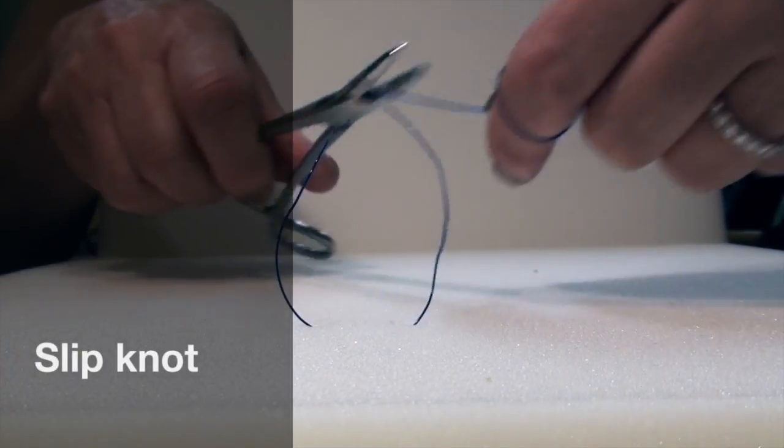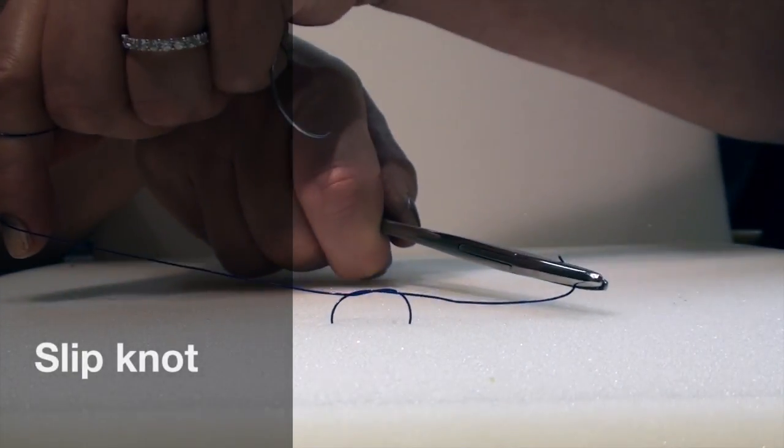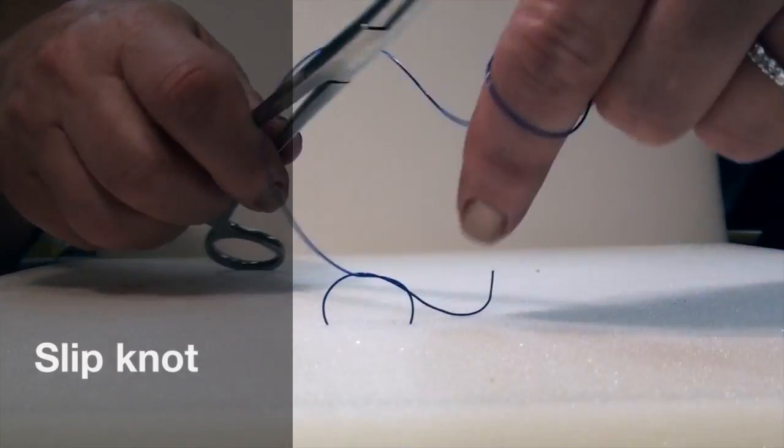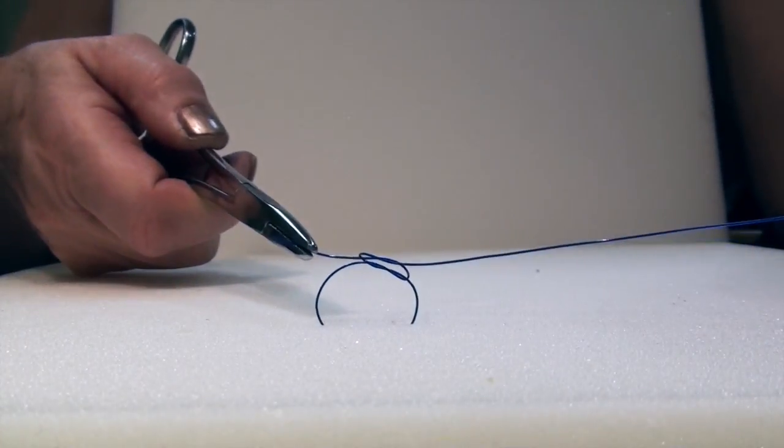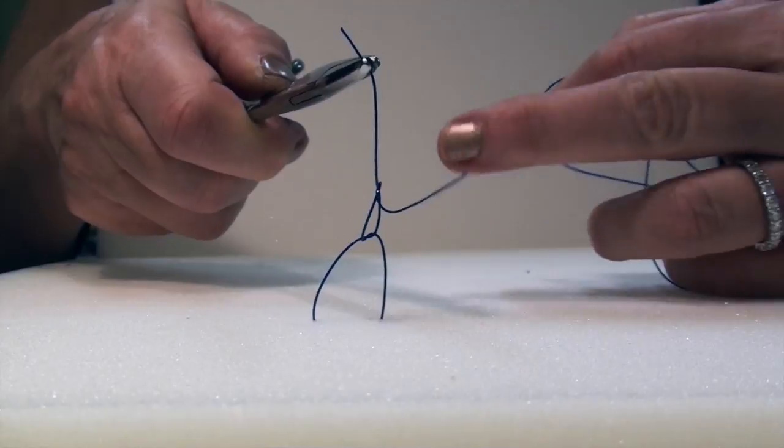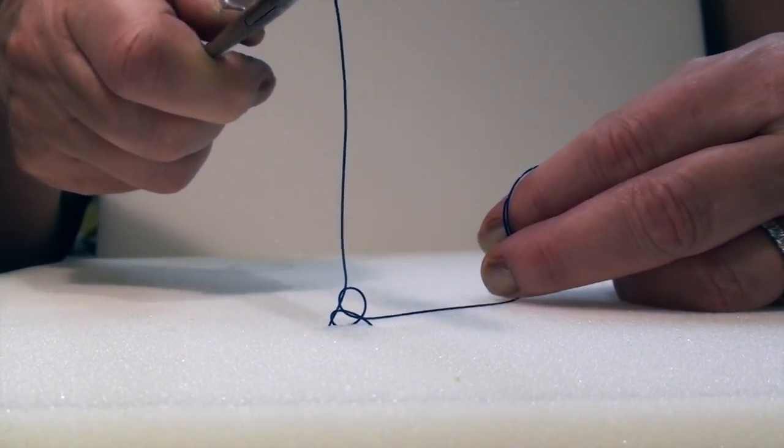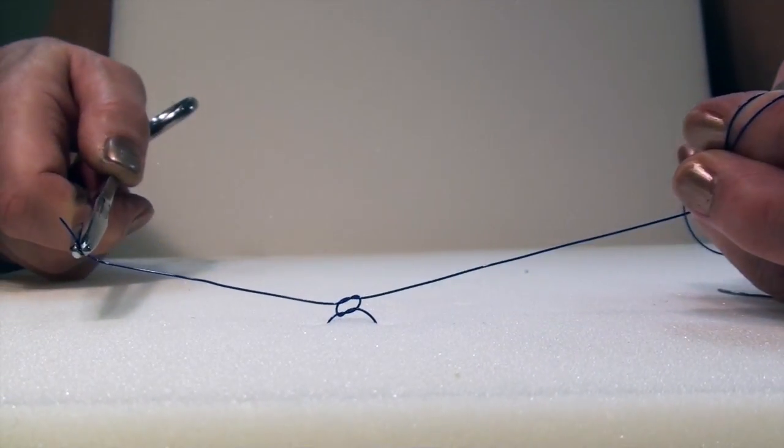A slip knot is a very useful type of knot to use, especially when there's a bit of tension on the tissues. It can be created using any type of suture materials, but the monofilaments do make a knot slip a little easier than the braided materials.